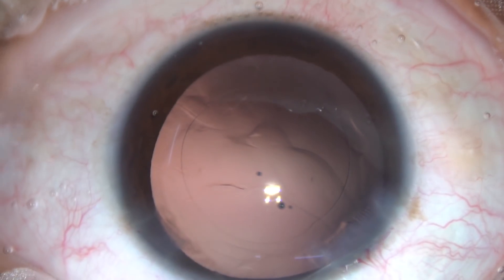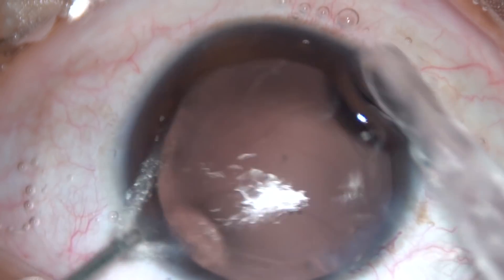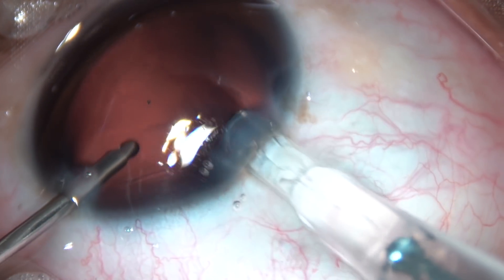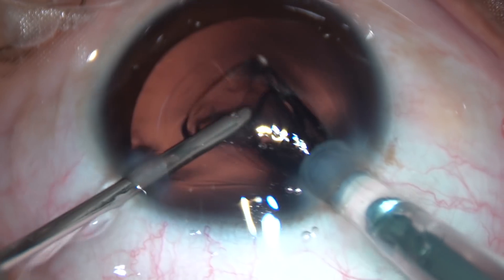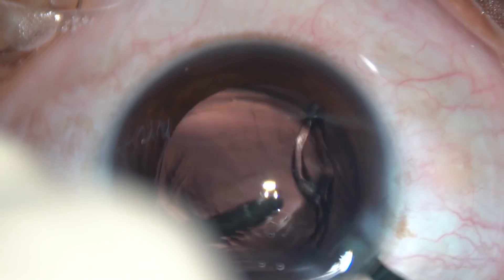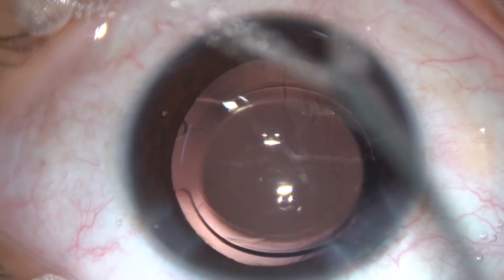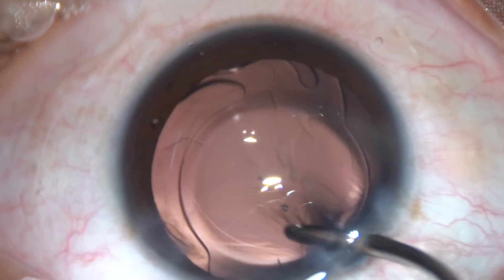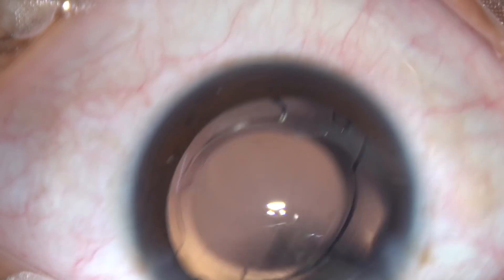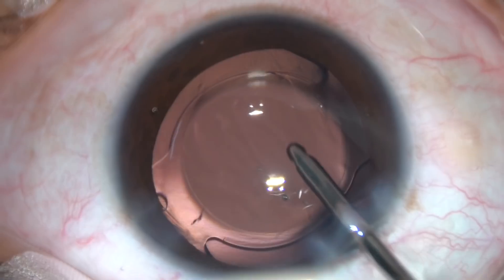A foldable intraocular lens is now being implanted under irrigation. The anterior chamber is kept formed by irrigating fluid and the lens goes into the capsular bag. The irrigating probe then enters through the main entry and dials the lens into position.